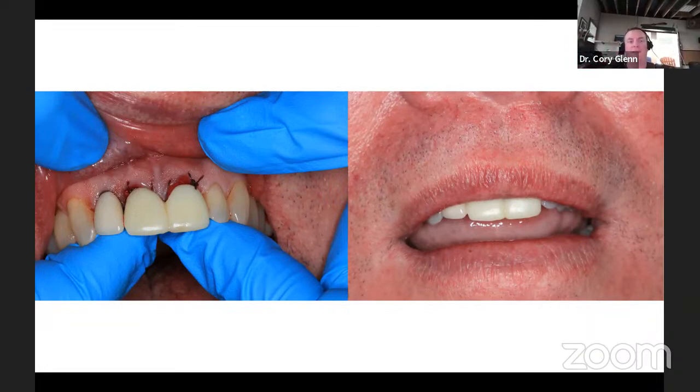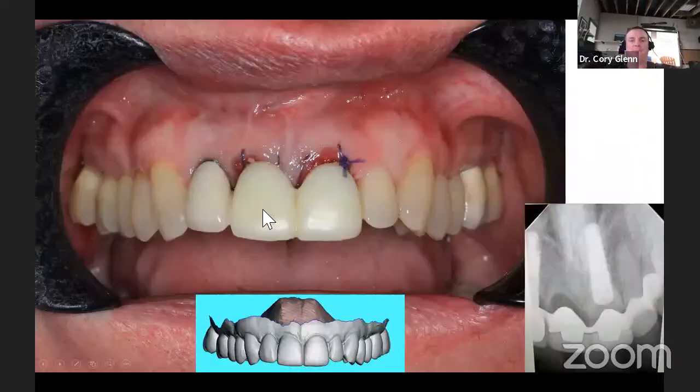But really the bandage to keep all of this closed is going to be this Maryland bridge that I've designed. So here he's cementing that in place with just a resin cement. More than likely this will just be able to be popped off by taking a crown tapper and just aggressively popping down on it. But if not, those wings are thin. You can just abrade through those with a bur until it's weak enough that it'll just pop off.